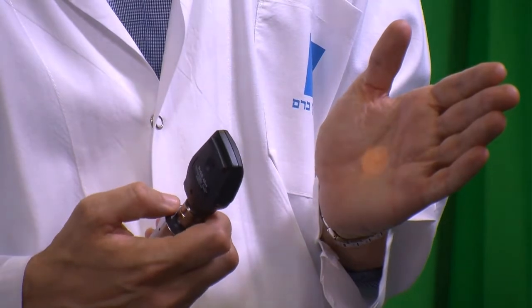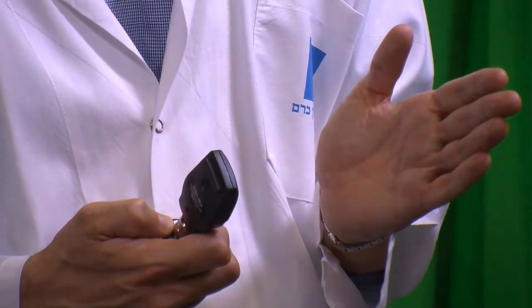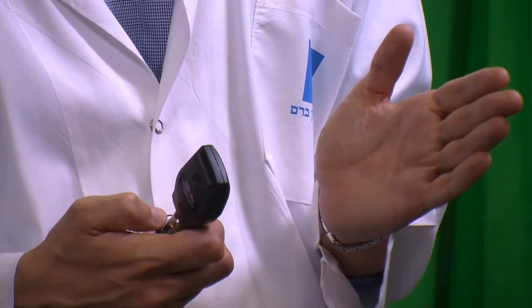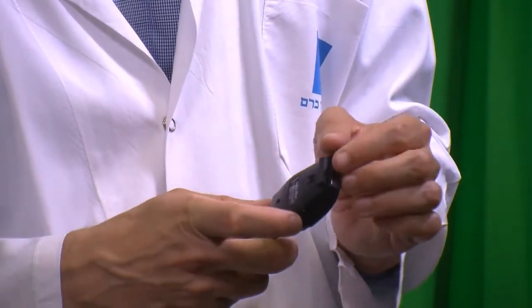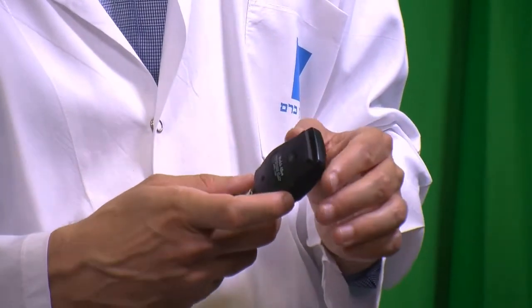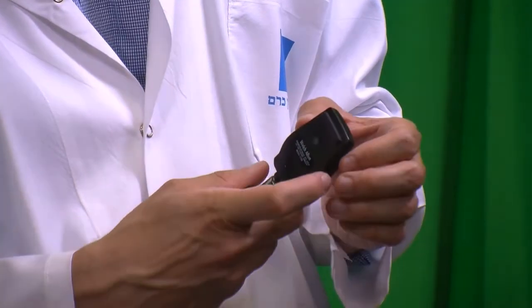The next thing I'm going to do is reduce my intensity of the light to the bare minimum until I can see it. This is very important to keep the patient comfortable and not to use more light than you need to. On my dial here, we have the focusing dial. And here I'm going to set it to a plus. There's plus and minus numbers. The plus are usually green. And I'm setting it to a high plus number of about 15.